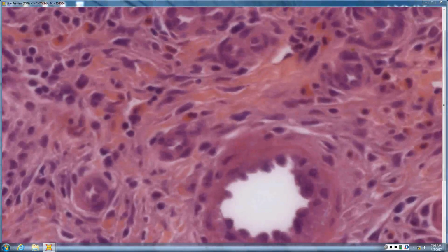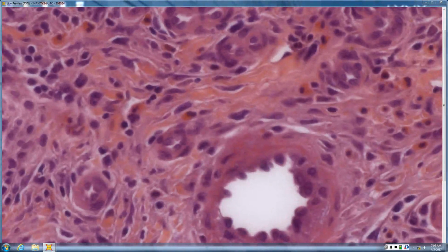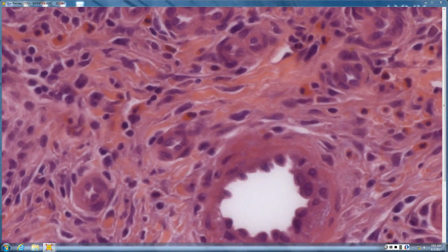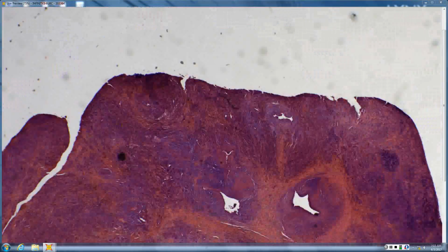Getting a little closer. So it just speaks to how these are kind of these little mounds, and they can be pretty pronounced hobnailing. And that can be a clue, obviously, for different things like THH and ALHE and other things where you get that hobnailing.